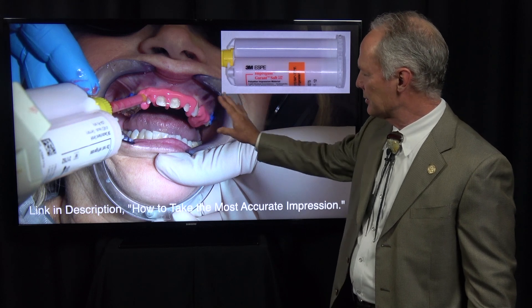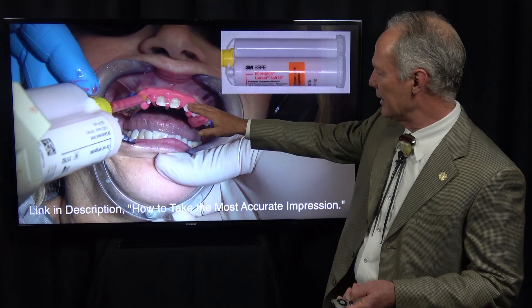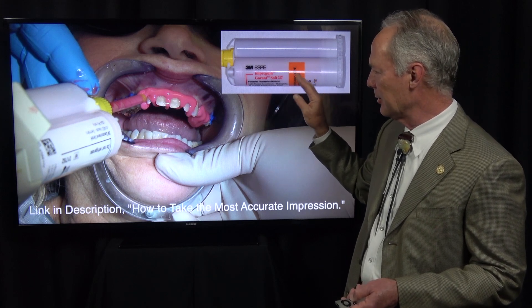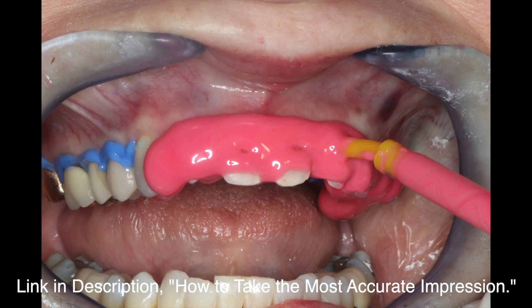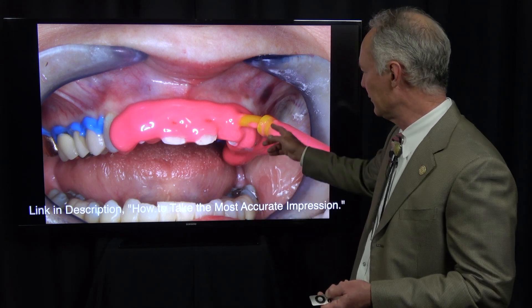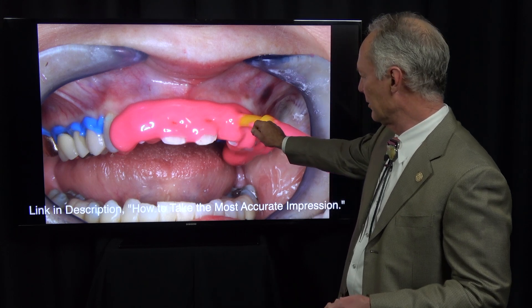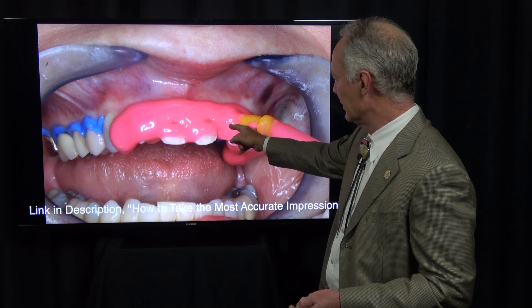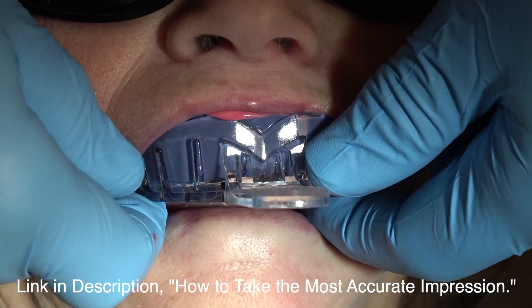Before applying the impression material, make sure the preps are wet. Polyether is hydrophilic — it likes water. Polyvinyl siloxane is hydrophobic and does not like water. That's why I'm a fan of polyether. You can wet the teeth and tissue and it acts as a lubricant so the wash material goes right down to the margin. You don't have to squirt this on the teeth — you can just leave it on the body material. If you do squirt it on the teeth, keep the tip in the material and don't take it out and reinsert it or you'll get air bubbles. Also cut the yellow tip off — it's too small and comes out like a needle. Cut it so you get a bit more volume of material out of the tip of the syringe.